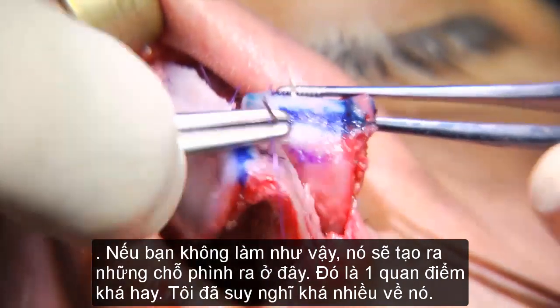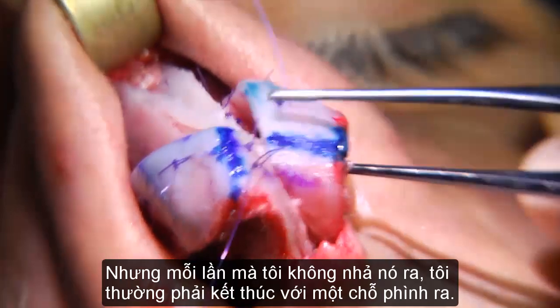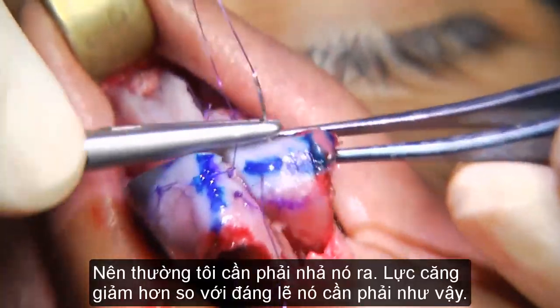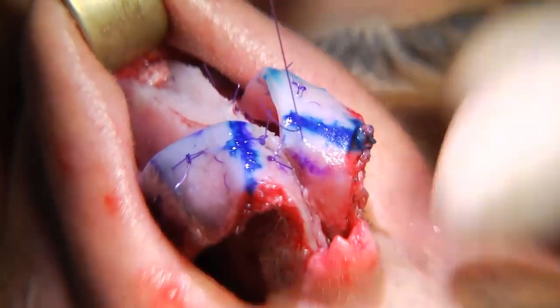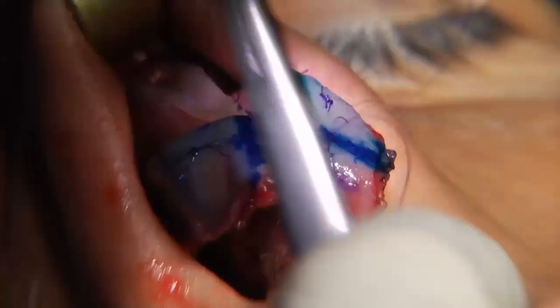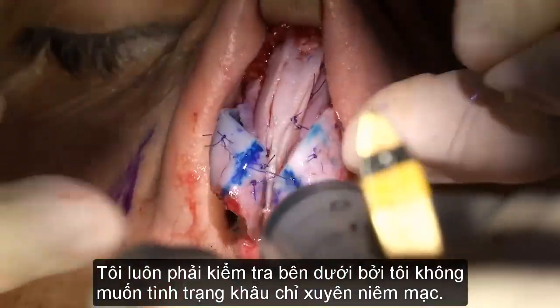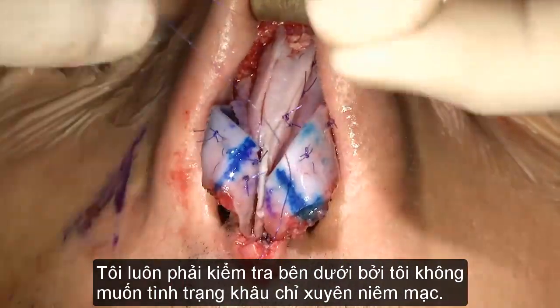Every time I didn't release it, I ended up with a bulge, and so I had to release it. So that tension is less than what it could be. I always check the underneath because I don't really want a through and through suture.